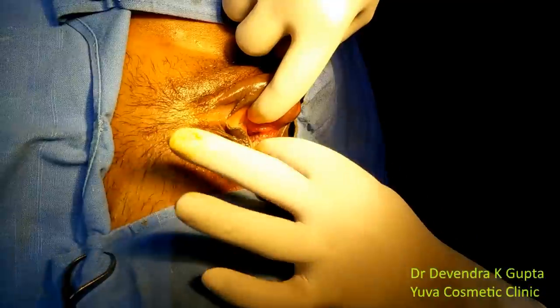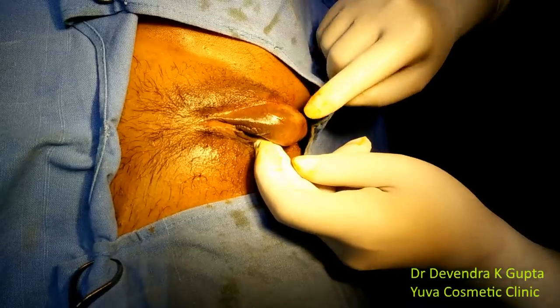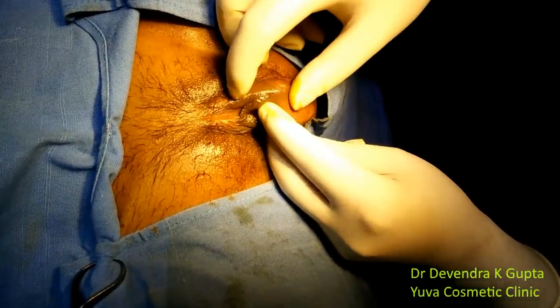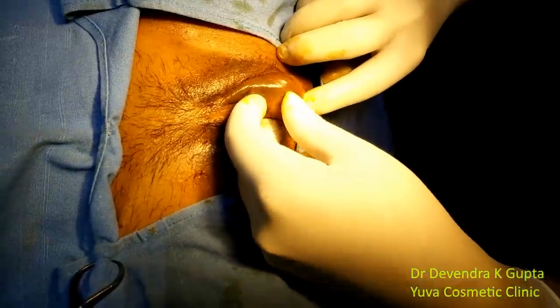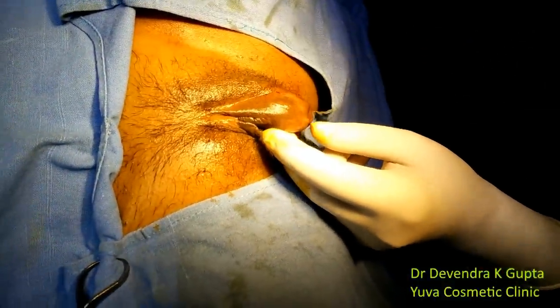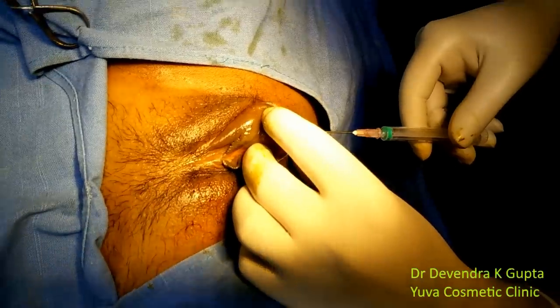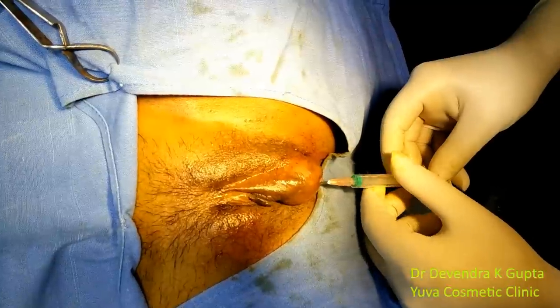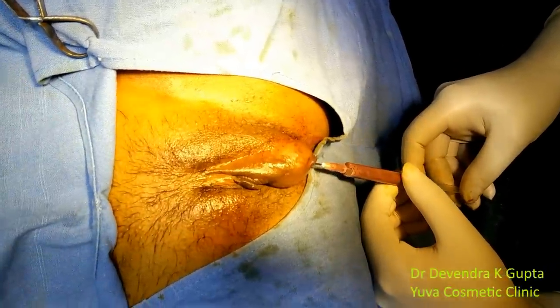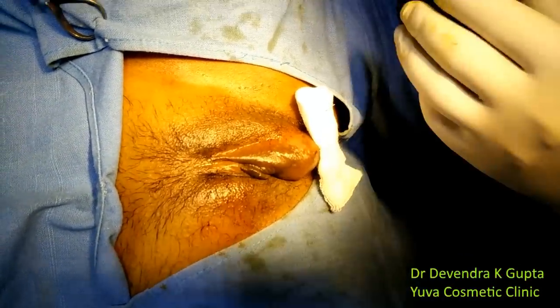Recurrent Bartholin cyst — I have given spinal anesthesia here and you can notice the deformed labia. This is the cyst that recurred after one year; in fact there is abscess formation. The patient couldn't sleep for the last two or three nights. I am taking a diagnostic tap at the most prominent point — this is for culture sensitivity.